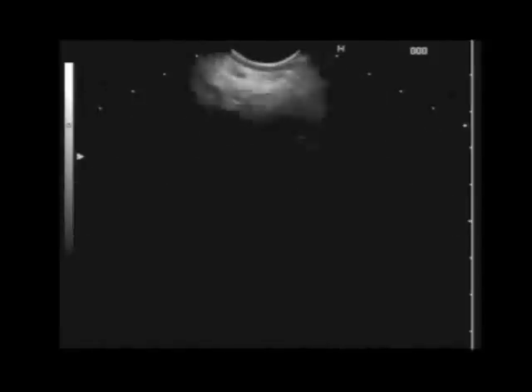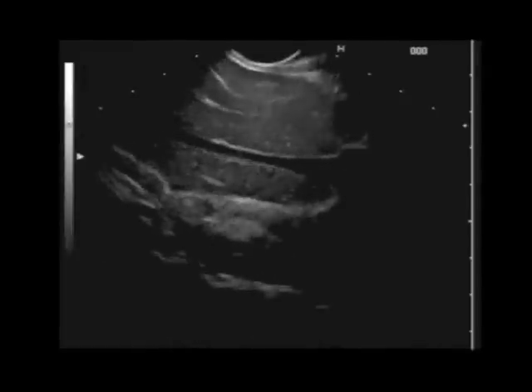I will perform the biopsies now. But first, just to make sure she has no hepatic metastasis. Do you want to check the liver first? Yes, because if you have a metastasis, it will really change the management. Even just for the prognosis, I think it's very useful.